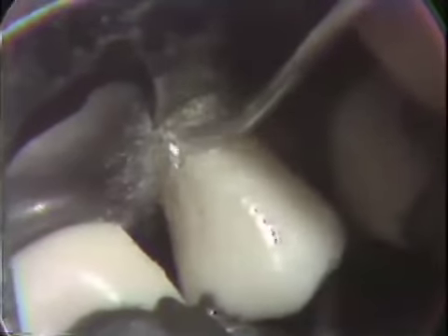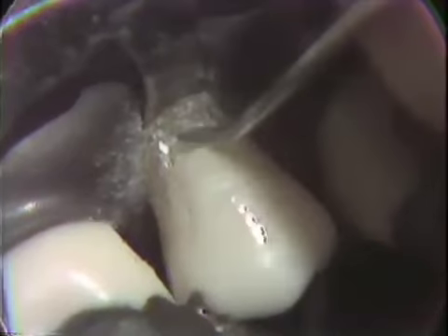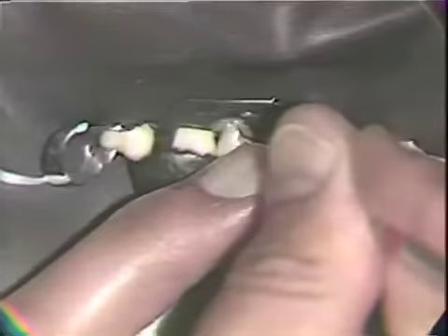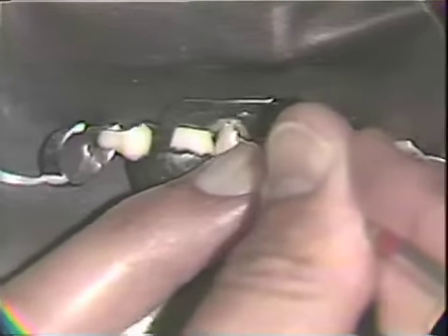Getting that in the central area and working off to the mesial, it's oftentimes necessary to use one hand in guiding the instrument, the other in the application of force.